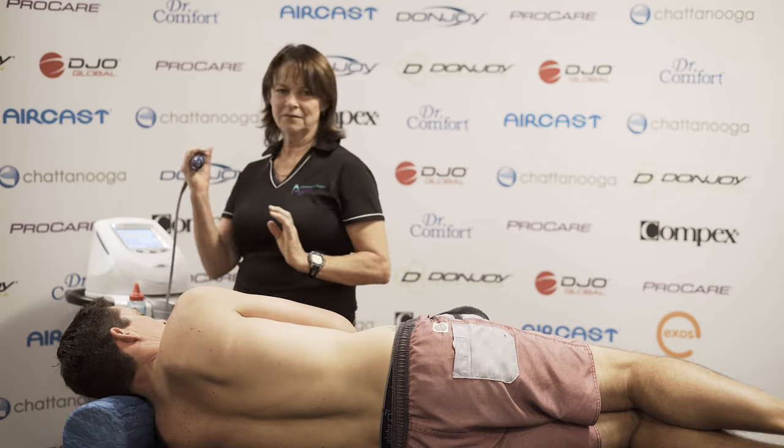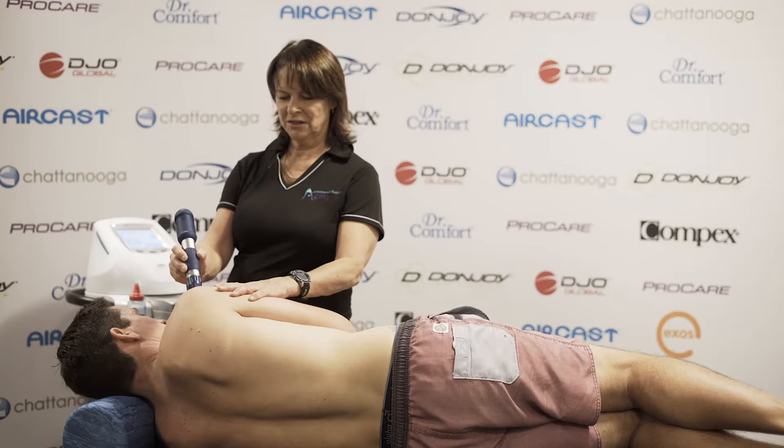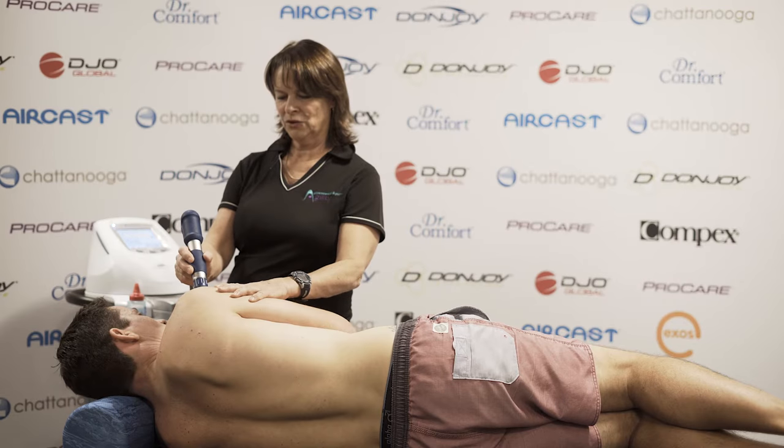Then we take the shockwave machine and apply it directly to the skin, just gently moving it, allowing the shockwaves to penetrate into the tendon.